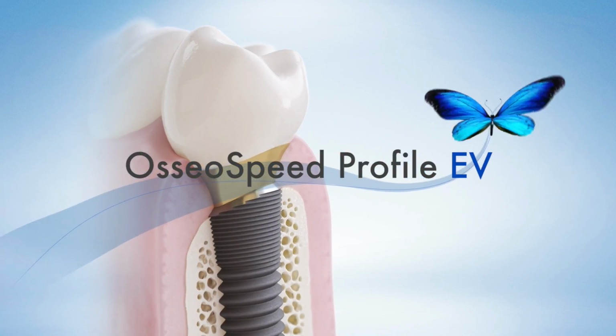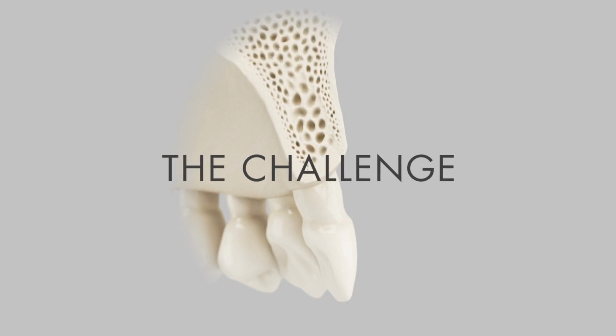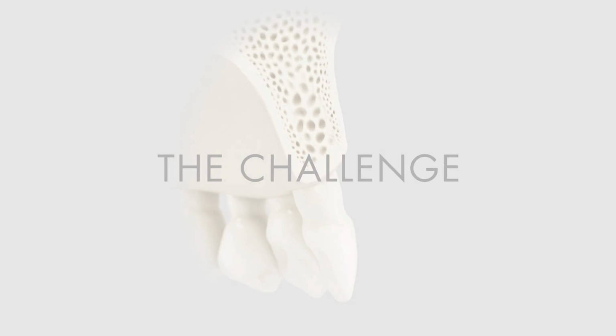OsseoSpeed Profile EV. A unique solution to a common clinical challenge.